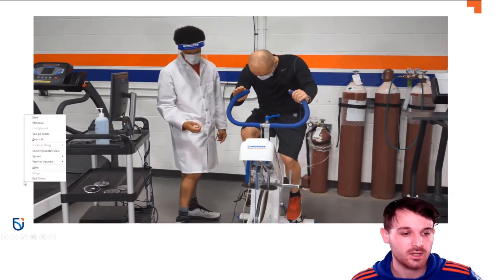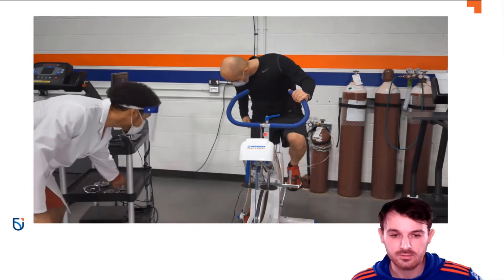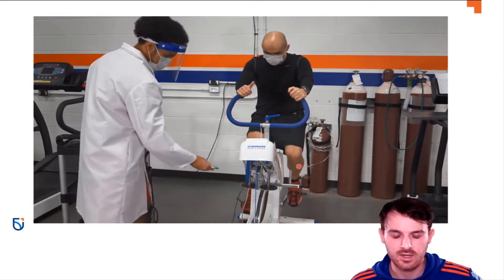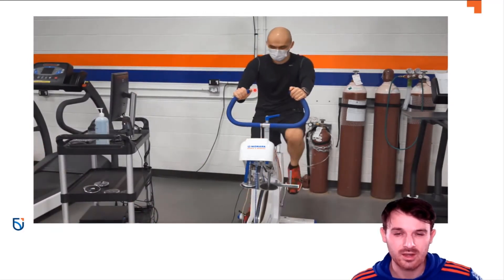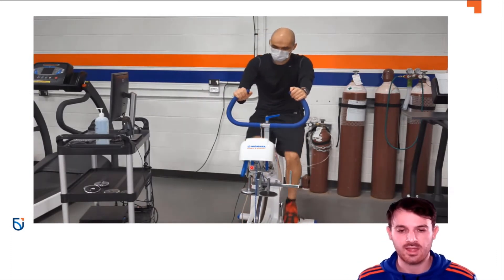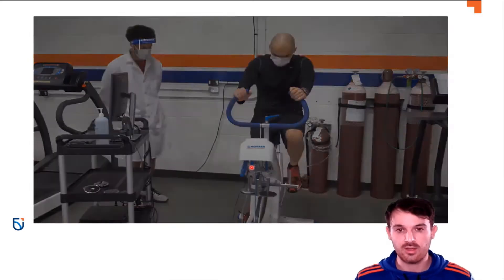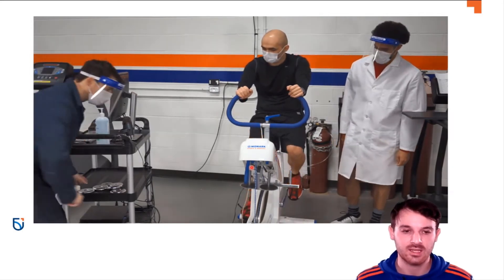You can see the weights ready to be loaded. Keeping in mind that the basket itself is 1 kilo, the experimenter ensures the participant is set up at the correct seat height, feet in the baskets, and can start pedaling. Make sure the basket is up and the participant feels comfortable. I always get them to press the button and see how the basket drops — especially for people new to the test, since they're cycling at high speed and need to know exactly where that button is.